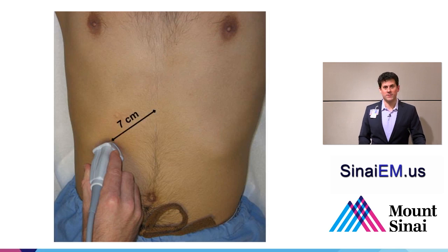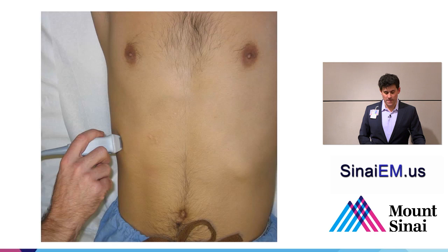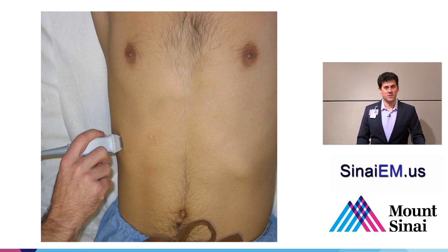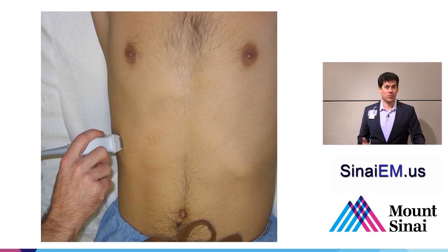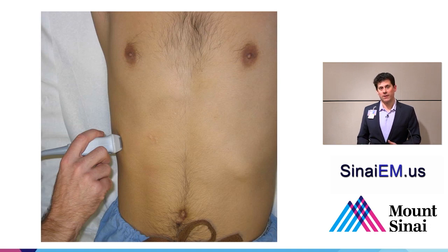The gallbladder is going to be found about 7 centimeters from the xiphoid process — "X minus 7," as some in the ultrasound community say. Start with the probe there. You can also start in between the ribs, especially if a patient is heavier or has a lot of bowel gas. Instead of imaging directly into the gallbladder, use the liver as a window. If you can't find the gallbladder right away, I usually give up, move towards looking for the liver, and then find the gallbladder from there.